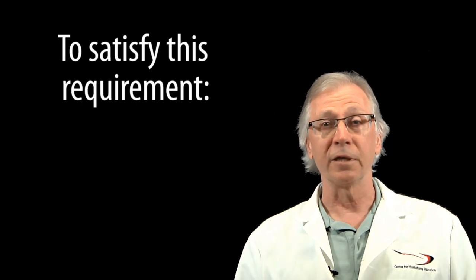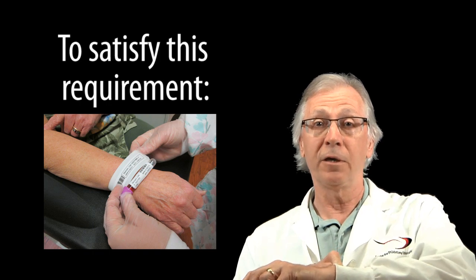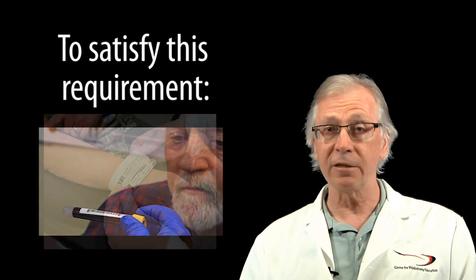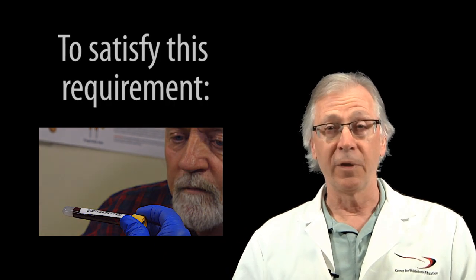We can satisfy this requirement in either of two ways. We can compare the labeled tube to the patient's ID bracelet, or we can ask the patient to take a look at the labeled tubes and confirm that they're labeled properly. If the patient is unconscious, sedated, or cognitively impaired, or has a language barrier, then we must ask the same person who identified them prior to the draw to confirm the tubes were labeled correctly.